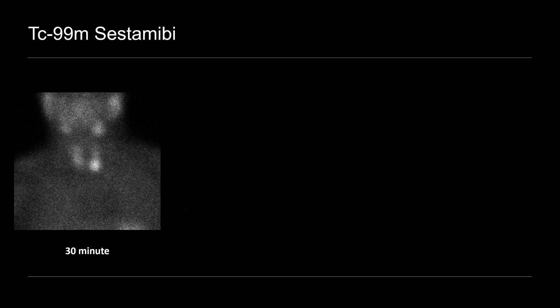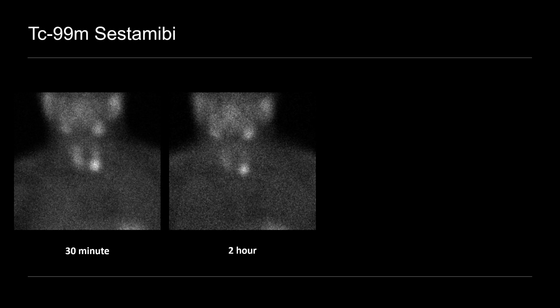This patient also had a technetium-99M sestamibi scan. Here we're looking at a coronal planar image 30 minutes after radiotracer injection. You can see normal salivary gland uptake bilaterally, also normal uptake in the right and left thyroid lobes. But then we see increased tracer at the left lower pole in the region of that parathyroid adenoma. On the two-hour delayed scan, the tracer has mostly washed out of the thyroid but is retained at the level of that parathyroid adenoma.